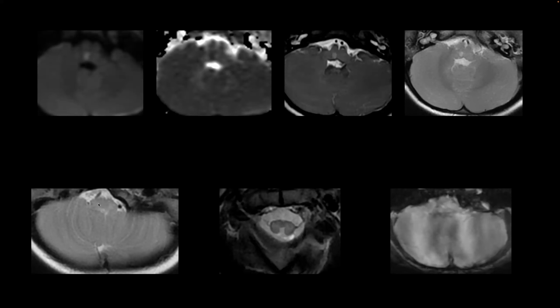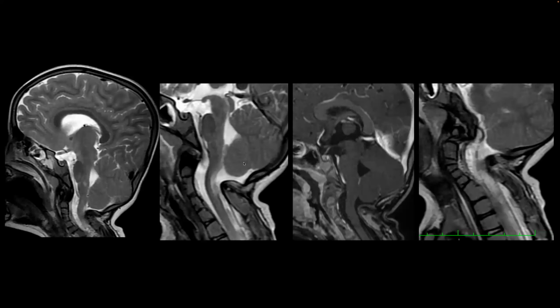And this area out here. My point is, you have mentioned that the cord, a little more than that much we are seeing in the axial, is also hyperintense, right? Yes, the second image. Do you see those changes in axials as well, like multiple sections, 1, 2, 3? It could be taken as artifactual, right? That's my point.